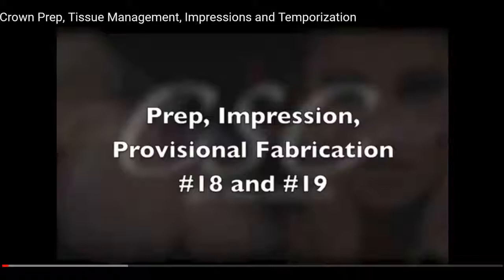When it comes to the fabrication of an indirect restoration, it is typically going to consist of 2 appointments. There are going to be exceptions because there are some offices that utilize a CAD/CAM system and they're able to fabricate indirect restorations in office as the patient is waiting. But typically it's 2 appointments.